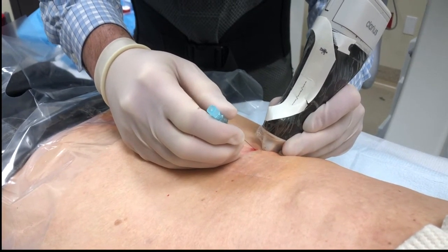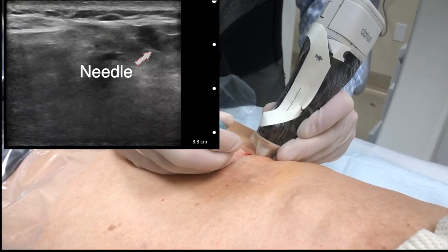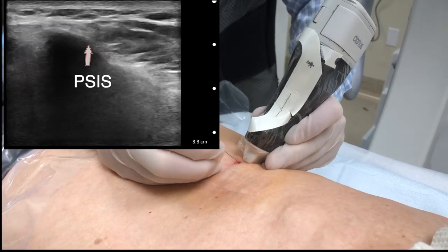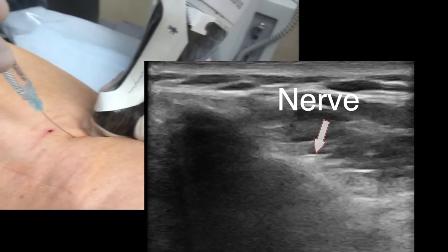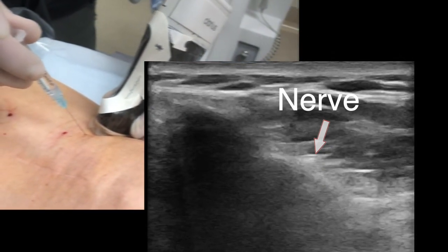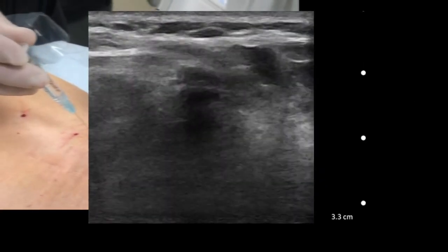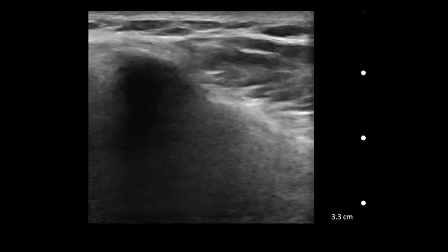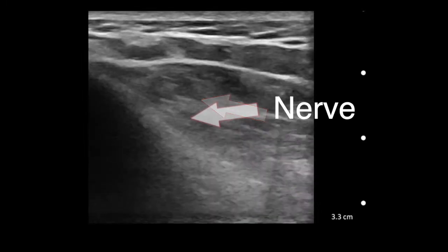First, I did a longitudinal view and identified and anesthetized the medial branch of the clunial nerve, and now I'm doing a cross-sectional view with a transverse approach. The nerve is quite small and difficult to identify. The best way to confirm a positive nerve block is to have the patient report a response with only one or two milliliters of lidocaine two percent. This patient did very well and is going to go on to peripheral neuromodulation.